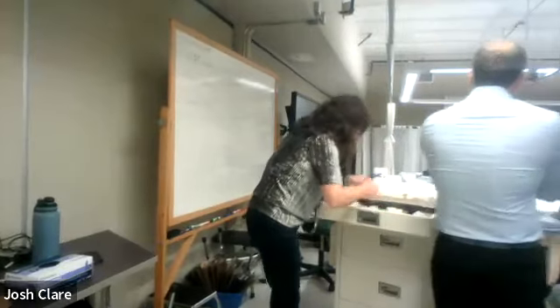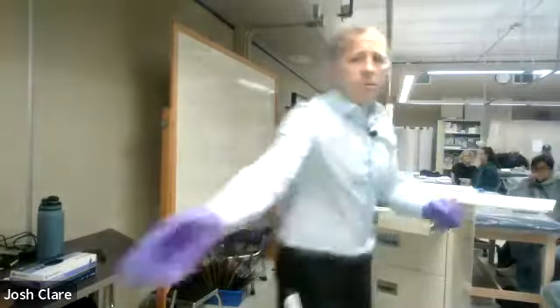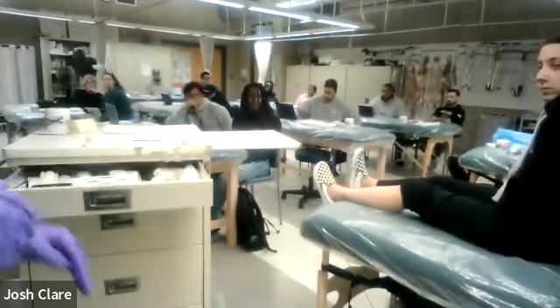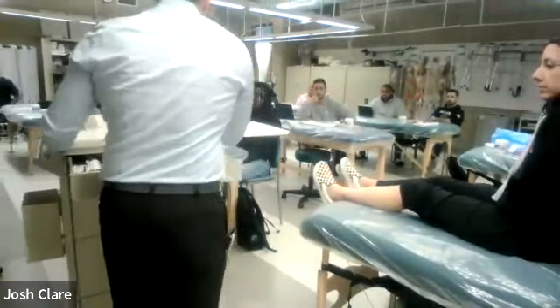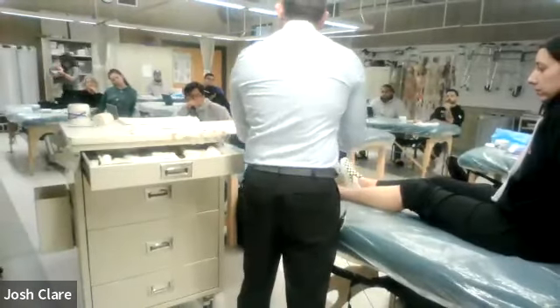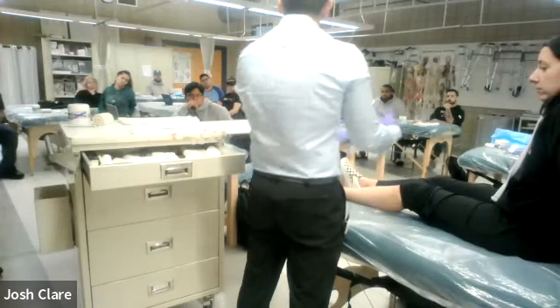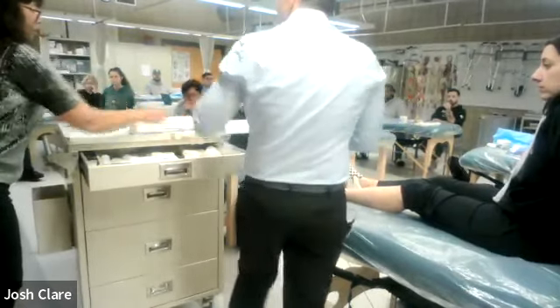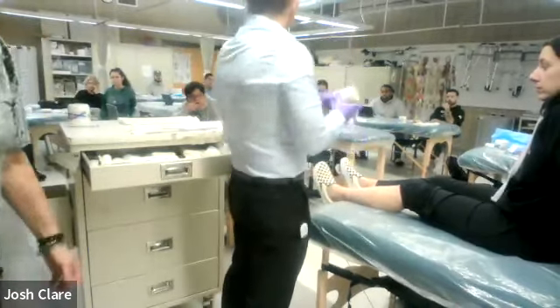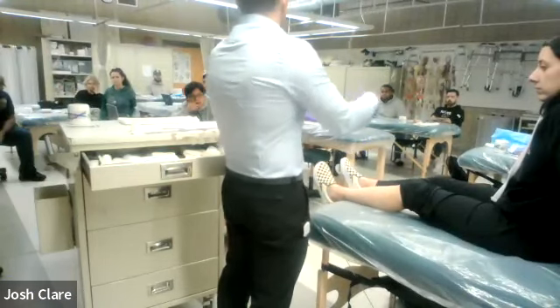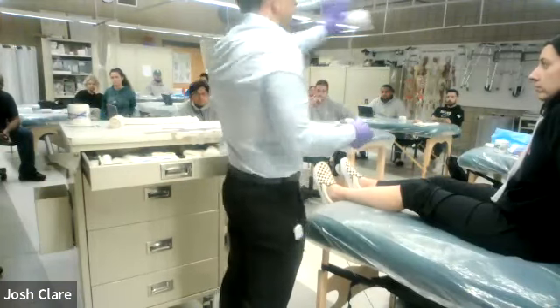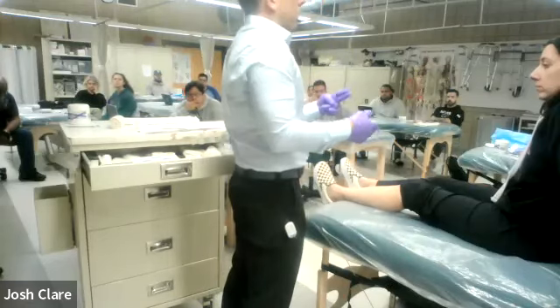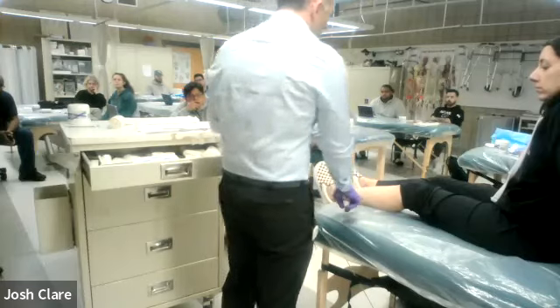Our first step would be donning non-sterile gloves, and then we would start taking down the dressing. For us in here we want to reuse everything, so we're going to take it down slightly differently than what would happen at the clinic. The top layer will be our ace wraps — we'll remove those and re-roll the ace wraps as we're taking them off the patient. The next layer would be the sterile wrap.